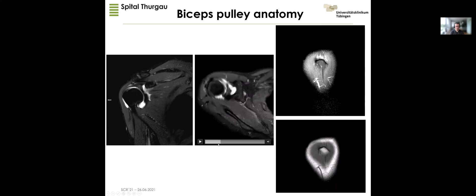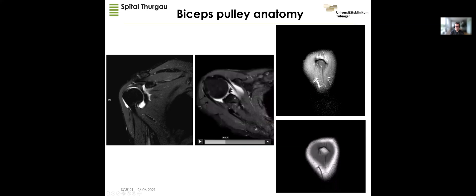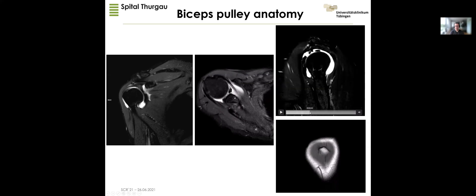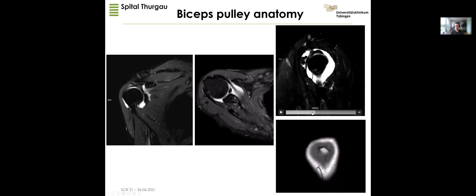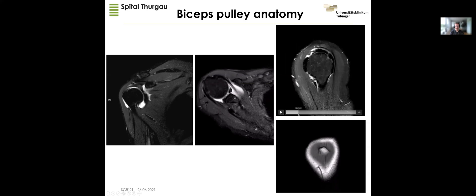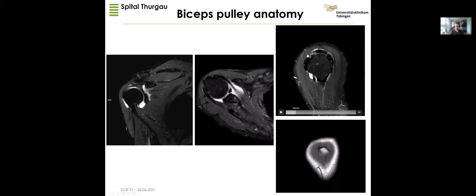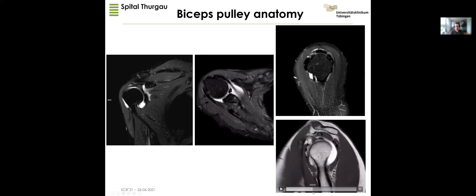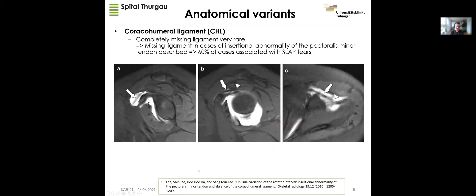It's difficult to see, and here is also the MGHL going down at the anterior labrum in a patient with a SLAP lesion. Better seen on the sagittal view, here is the long head of the biceps tendon with two bands of the SGHL — a normal variance. The structure is seen and there is still some space between the long head of the biceps tendon and the subscapularis tendon. On the T1 sagittal view it is important to detect fat around the joint capsule; if you don't see it, think of adhesive capsulitis.